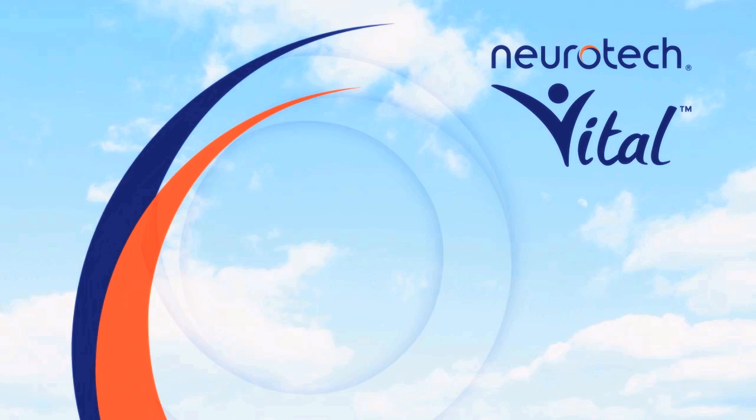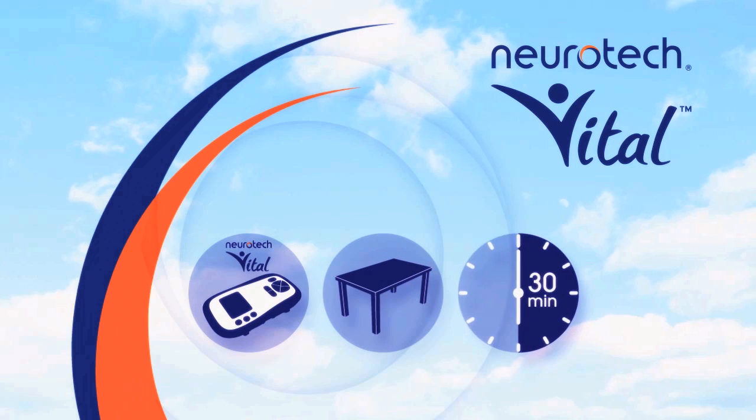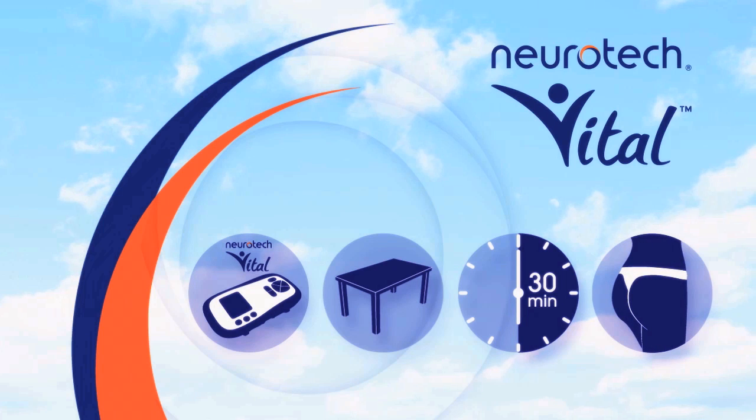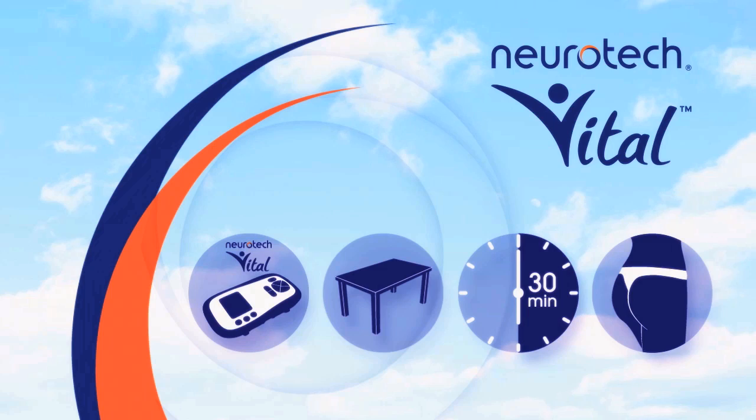All you need for a treatment session is your Neurotech Vital, a table and 30 minutes. Please put on underwear that does not cover your buttocks so that all electrodes will be in direct contact with your skin.